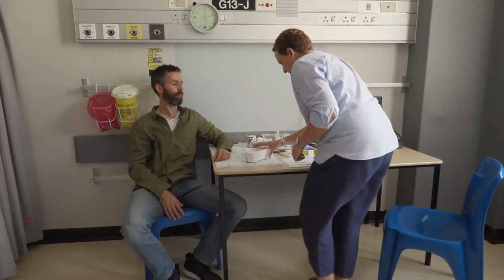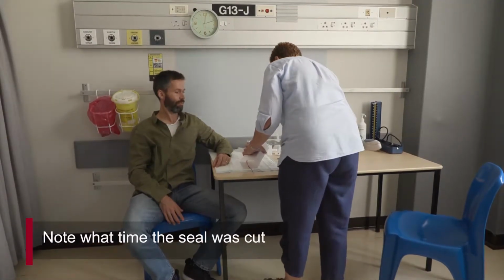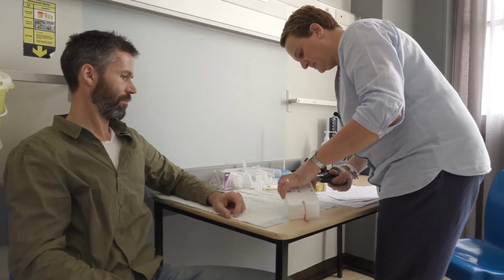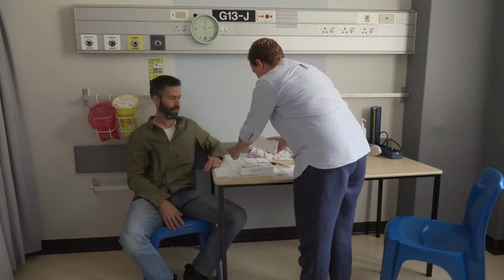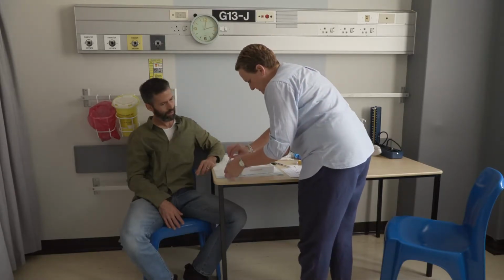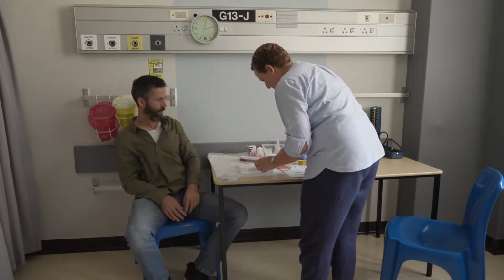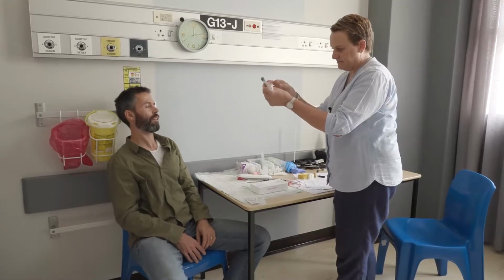Okay, let's have a quick look. So it is now 11 minutes past 12 and I cut the old seal. Here you go. So let's have a quick look. Here's our needle, here's our new seals. And then there's always a little bit of powder in there.